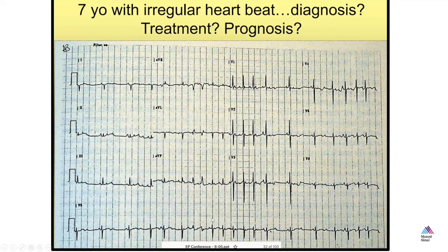But then in between here, can it be like an EAT? It could be EAT. That's a good differential diagnosis. But I think if you look at these leads, you could make an argument that, in EAT, there's typically 2 P waves, right? There's the sinus P wave and then the ectopic atrial P wave. But in this case, it looks like there's more than 2, right? So you have the sinus one, you have this kind of tall P wave, this little one, maybe a sinus one.